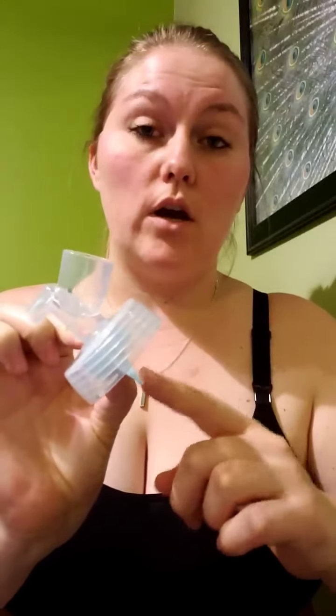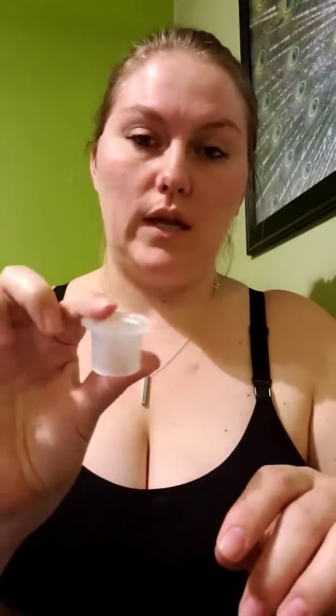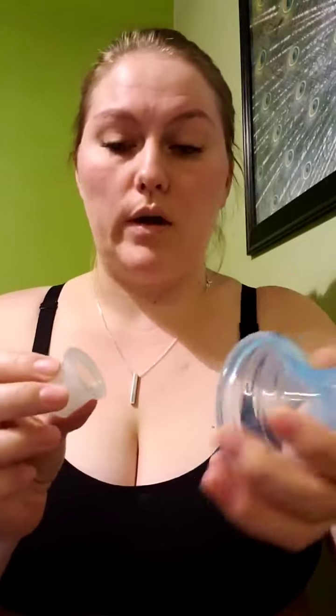I am using the blue extra small flange and I have my Spectra adapter with a duckbill valve. It does not come with a duckbill, so make sure you put one on there before trying to pump. And then it also comes with this little neck piece that goes between your flange and your adapter.